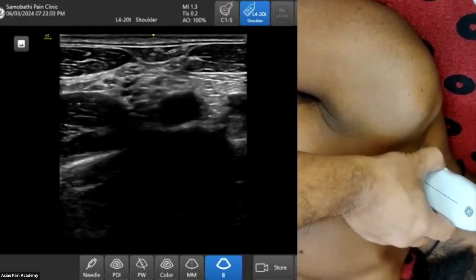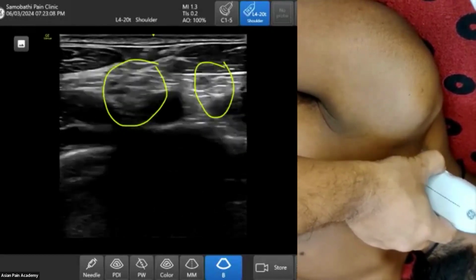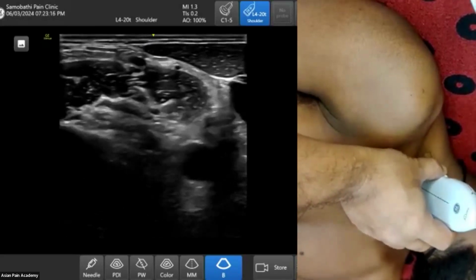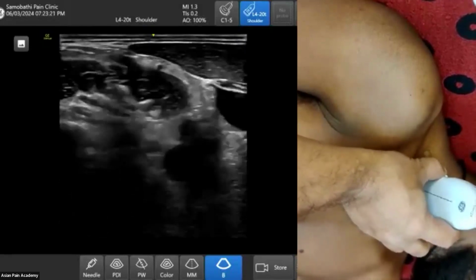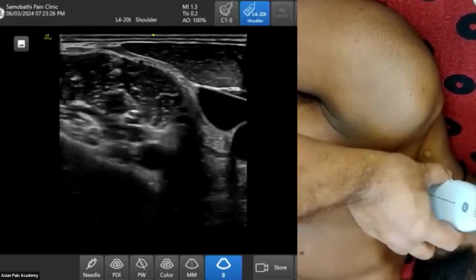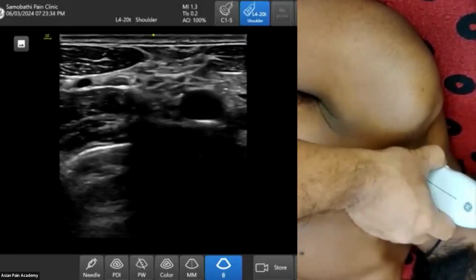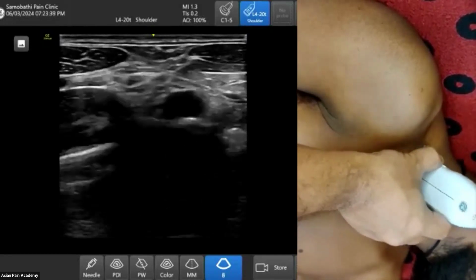So this is the big brachial plexus around the artery, right side. Okay, anyway, if I go up, I will see the anterior scalene and middle scalene, and all the branches, all the brachial plexus that is being formed. So here there is one traffic light sign. This is actually the interscalene area. When I come down, this is your supraclavicular block. This is the supraclavicular area.